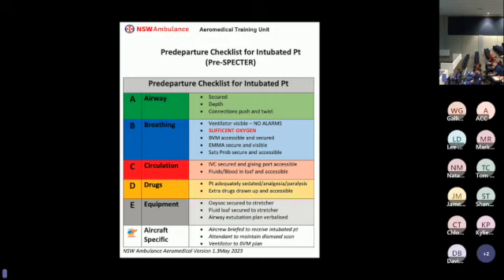Awesome. So there are no alarms. There is an orange indication alarm. There's no green alarms, people, right? So the orange alarm, everything's okay. It's all okay unless it's red. Right, good. So red alarm means bad, means do something about it. Okay, so we've got no visible alarms that are red when we start the procedure.